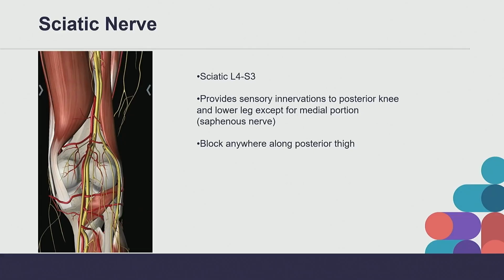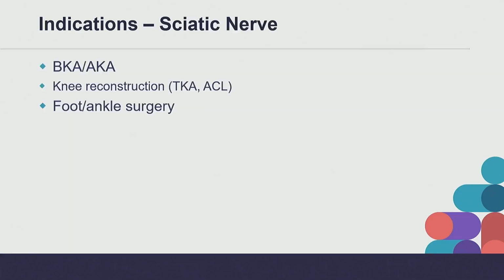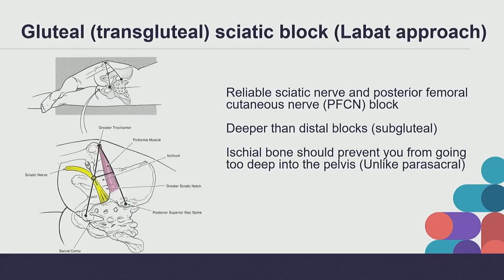It's a great nerve to block anywhere along that posterior thigh. It's great for BKAs, AKAs, ligamental work, as well as TKAs back in the day, but we no longer use this again because we want motor sparing techniques. And then really great for foot and ankle surgeries.